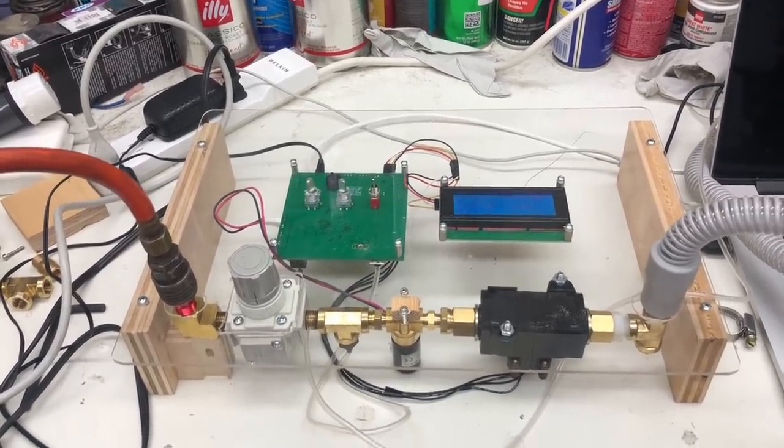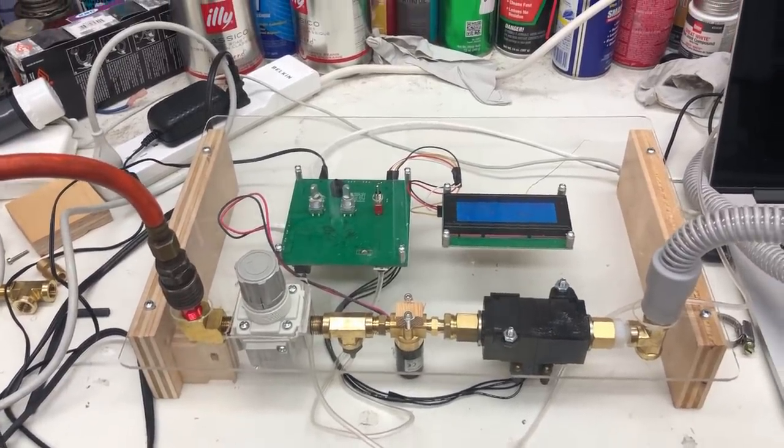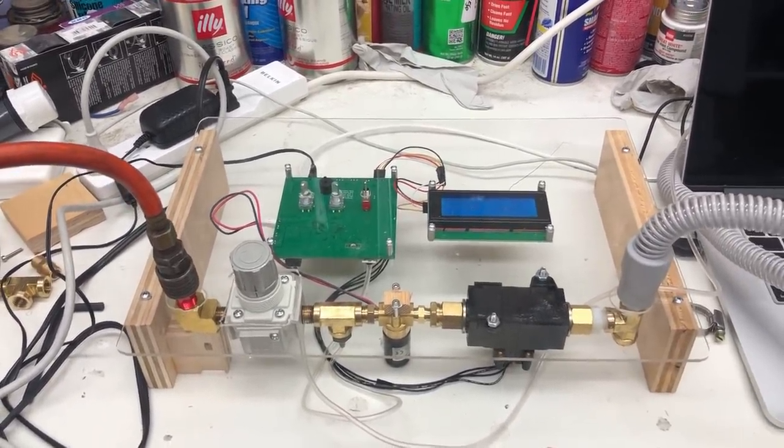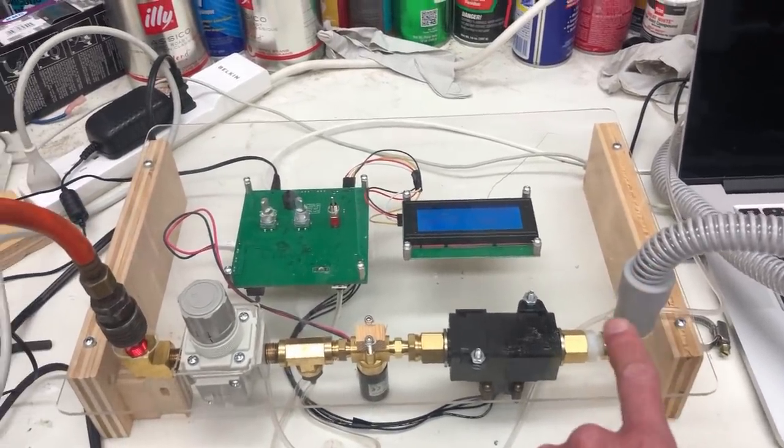The input is compressed air here. If compressed air is not available, this unit could be used with an air compressor to operate off of ambient air. The output is precisely metered flow and pressure of air.